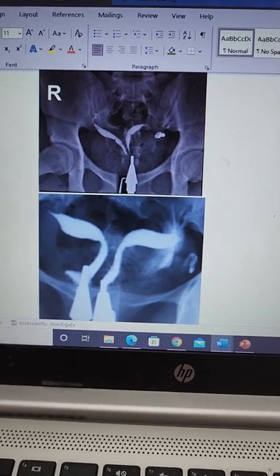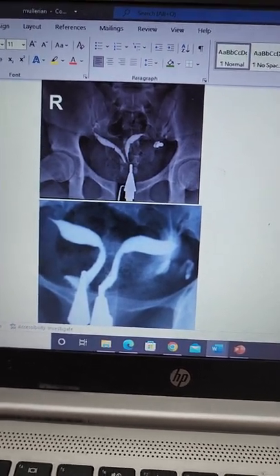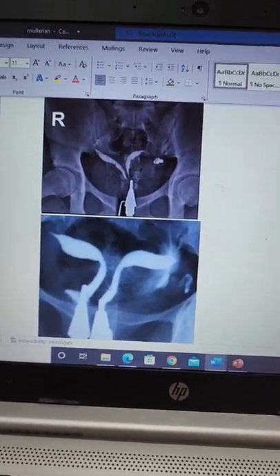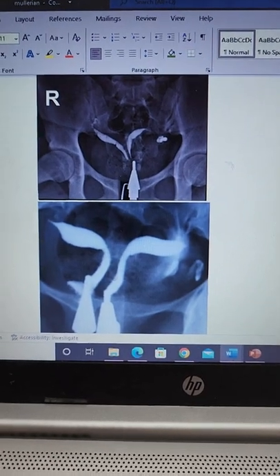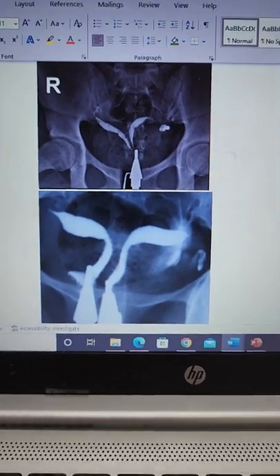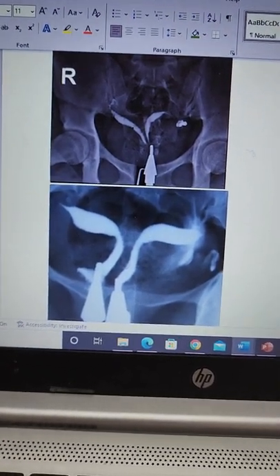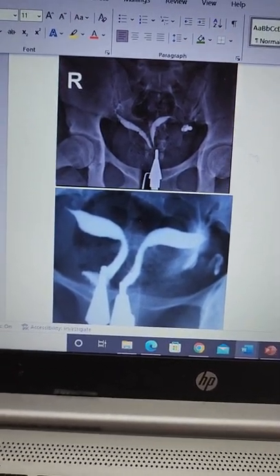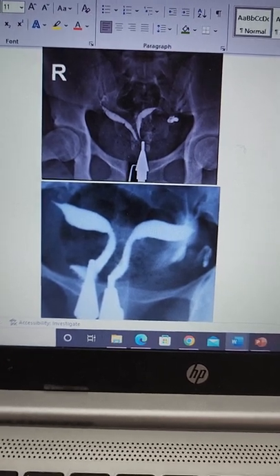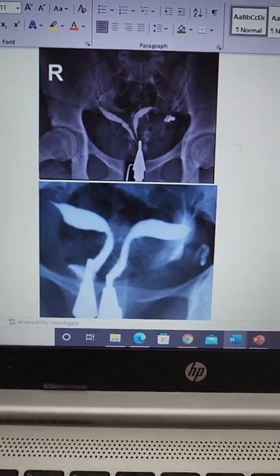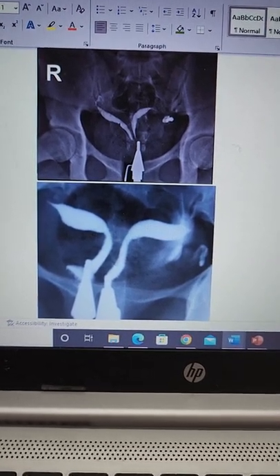Today we'll discuss a very important topic: differentiating three uterine anomalies on an HSG or a 3D ultrasound. The three anomalies which commonly get confused are a uterine didelphys, a bicornuate uterus, and a septate uterus.